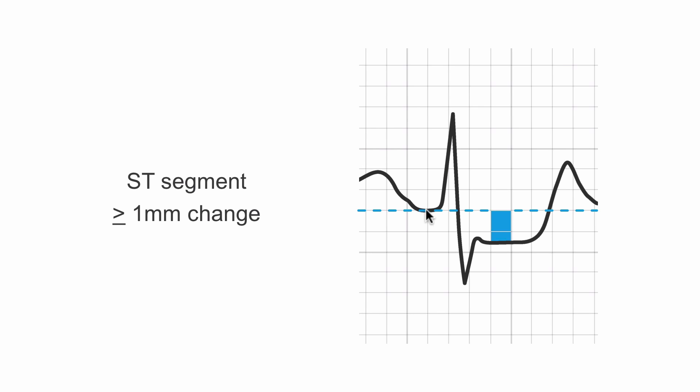Here we have our baseline PR segment. Here's our ST segment. Here we're about one and a half boxes, so this is significant, greater than or equal to a millimeter.